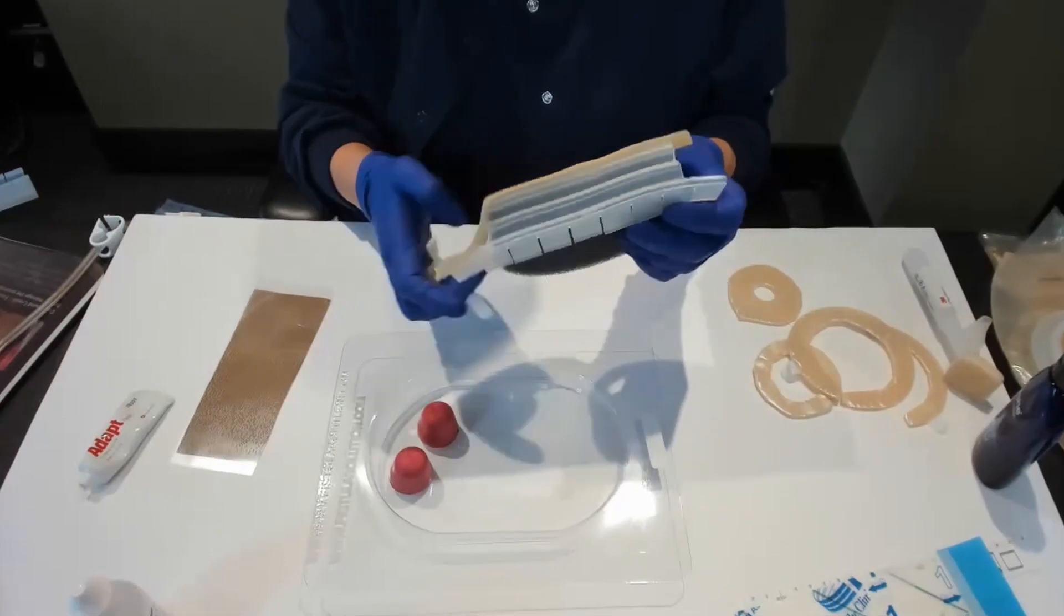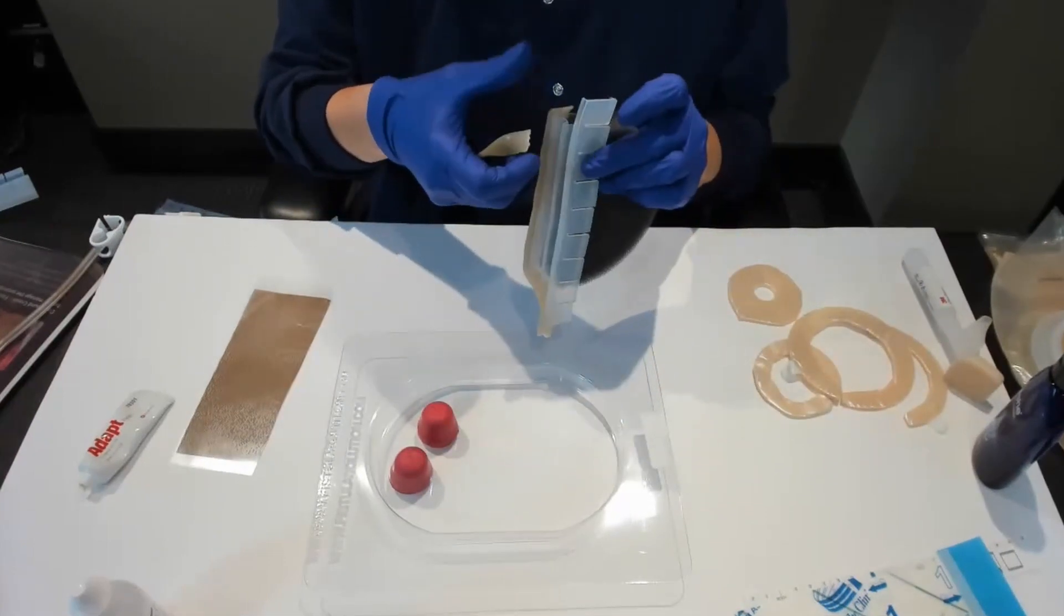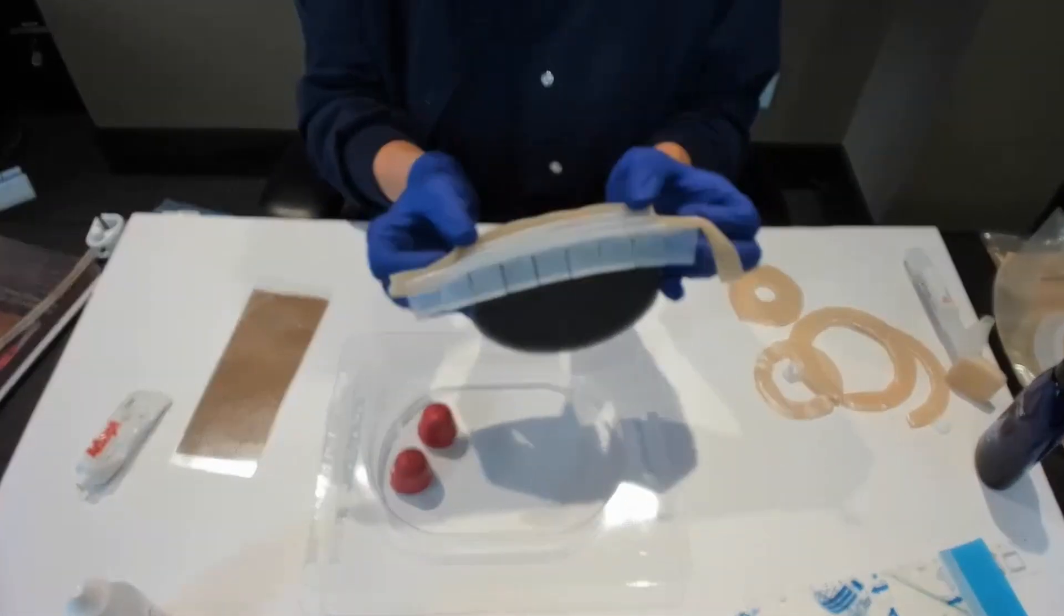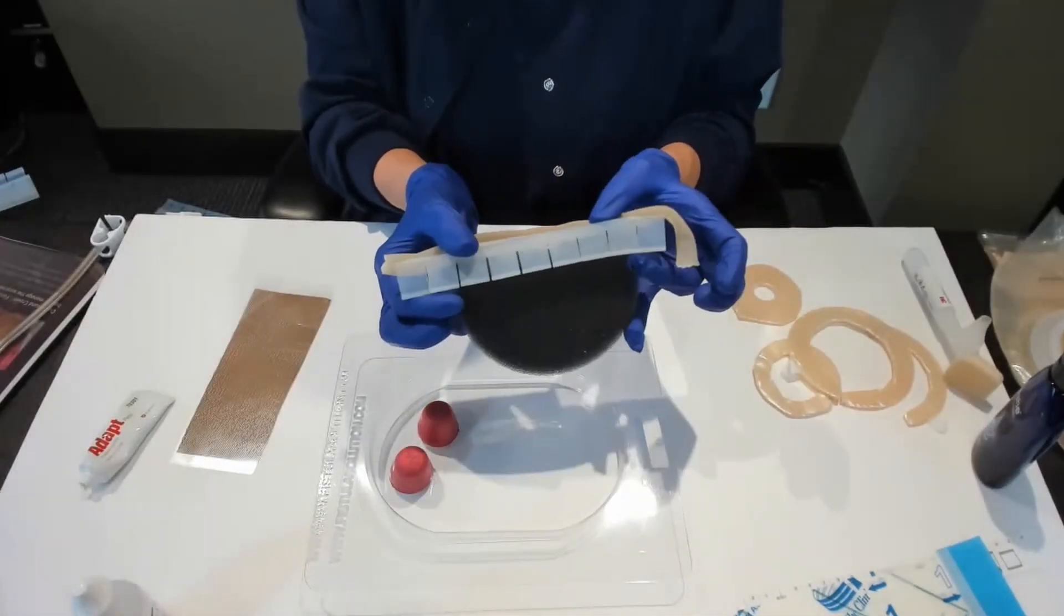So it looks like that on both sides. You can see it on the inside. You can see it on the outside.